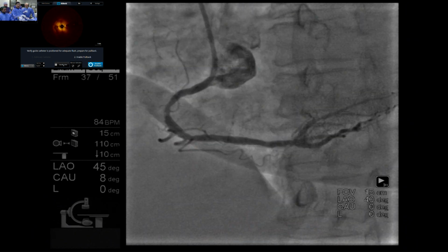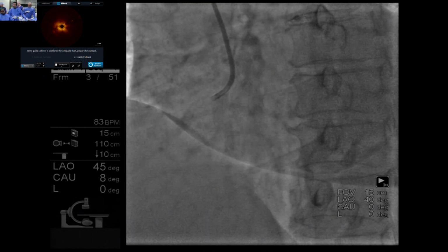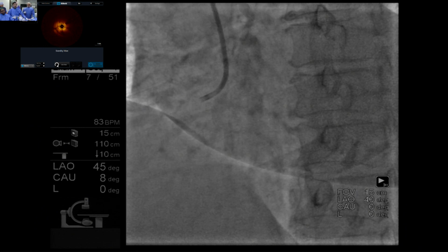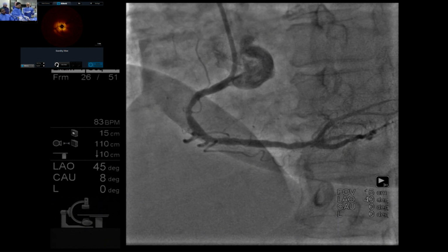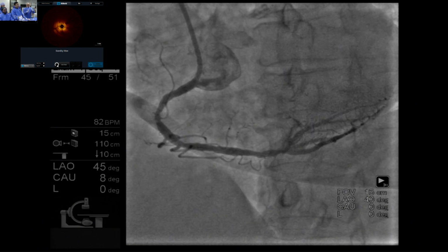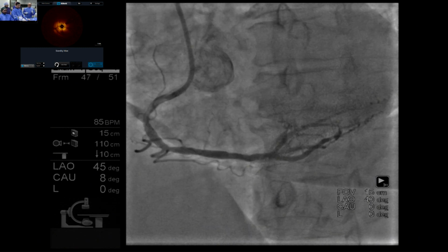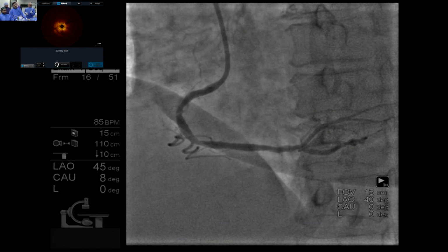Yeah, and another thing, Khalid, I have heard quite a bit, even from the panel yesterday, that if dissection happens, you cannot sleep and there are heartburns. But one thing I tell you, heavily calcified lesion, it is my 32 years of interventional experience. If you dilate and if the artery looks good, well open, and if there is a little bit of haziness with some dissections here and there, normally they don't recoil, because I think there is hardly any elastic tissue in that area to recoil.